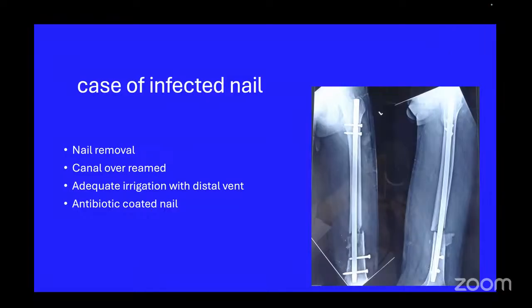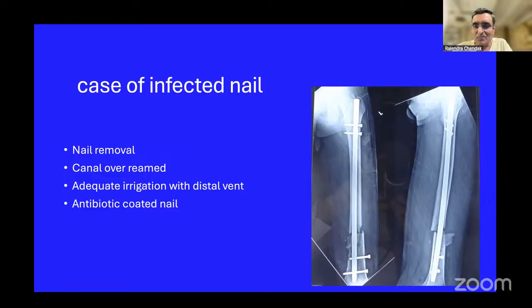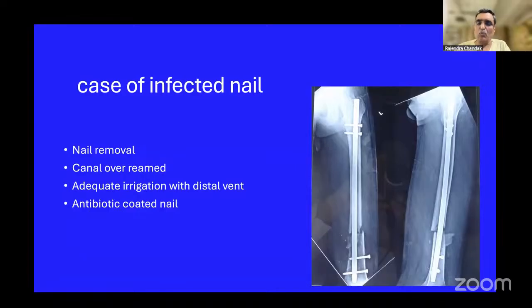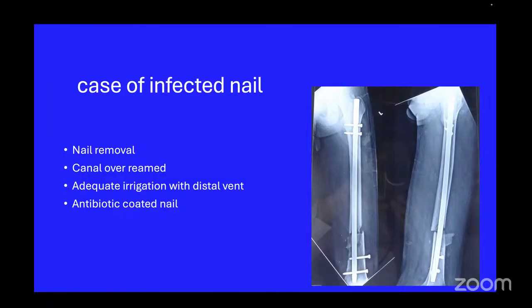Yeah, removal of the nail, freshening of the fracture site, with a cement spacer, and I would rather apply a lateral locking plate, a long lateral locking plate. I think that's perfect. So what you are describing is good debridement, good mechanical stability, providing a plate from the lateral side, and good antibiotic elution. I think that is perfect. Absolutely perfect.